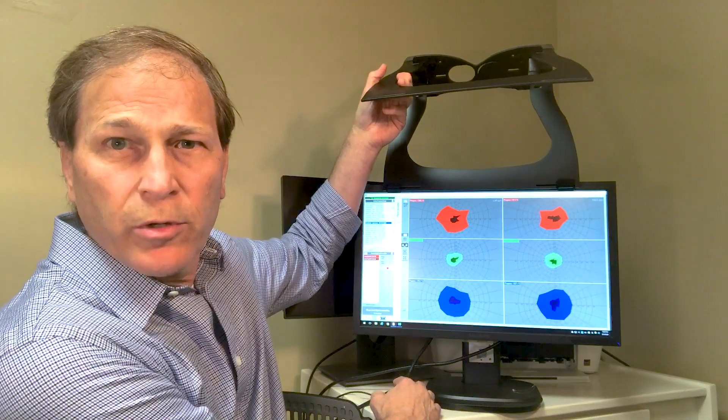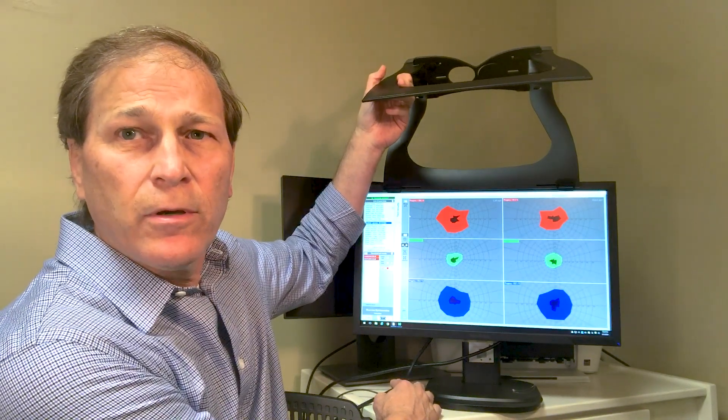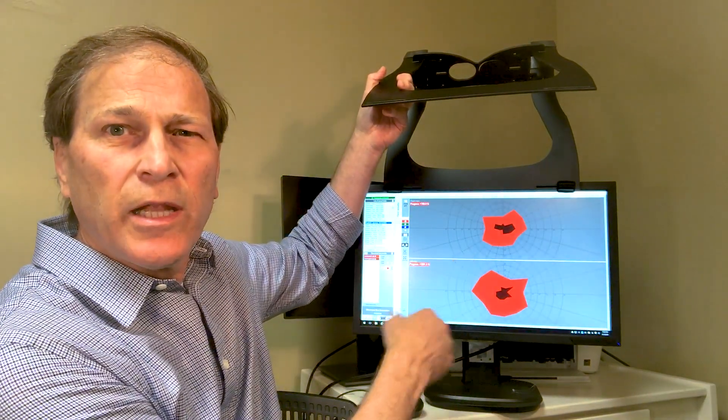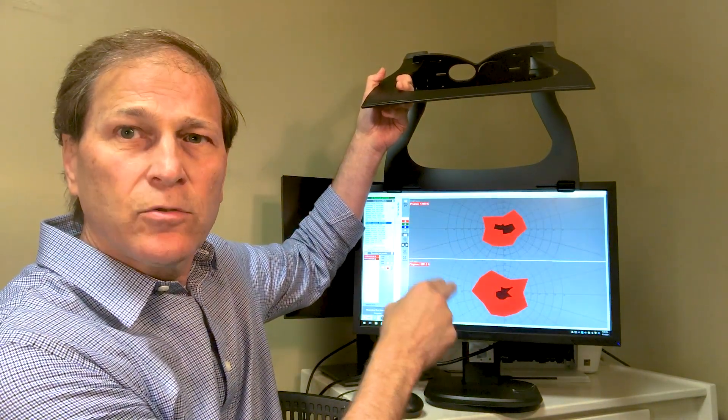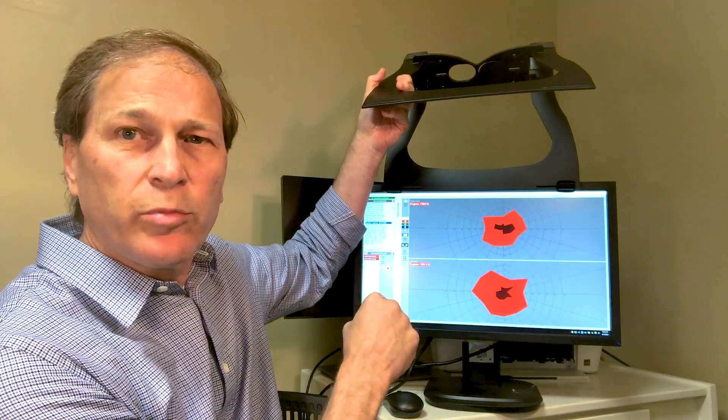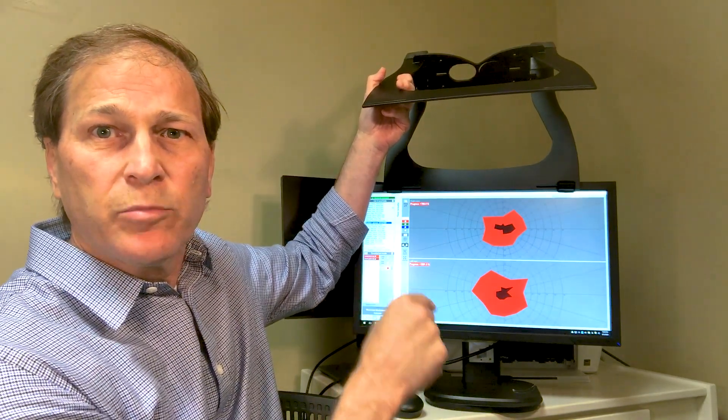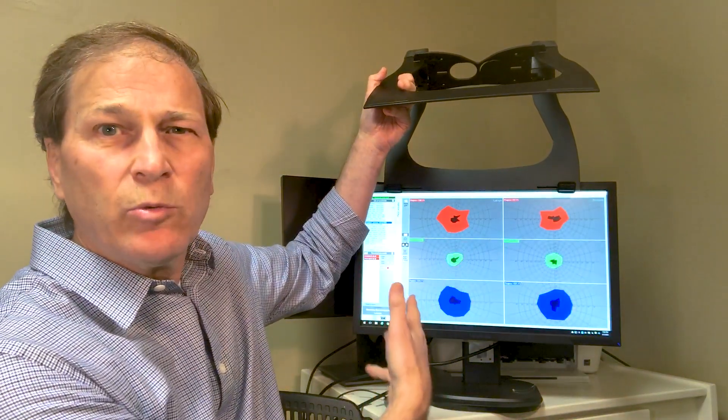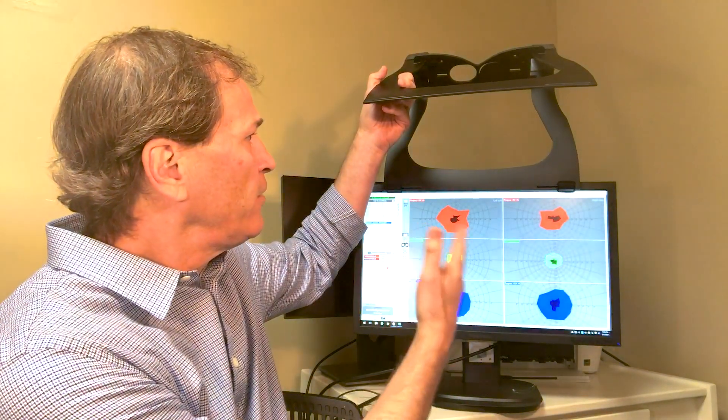Automatically the computer keeps track of before and after therapy field results. For example, here's a red field, the light area being the most recent field, superimposed onto the original field before therapy. The dark area is pre-therapy. And you can show this for any of the colors or all of them at once. Right eye, left eye.